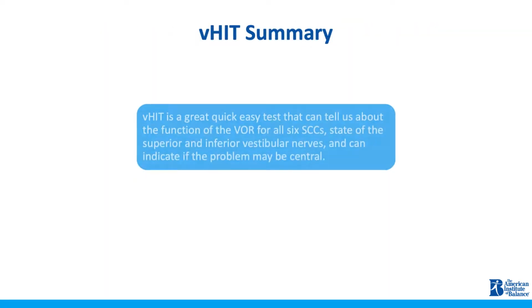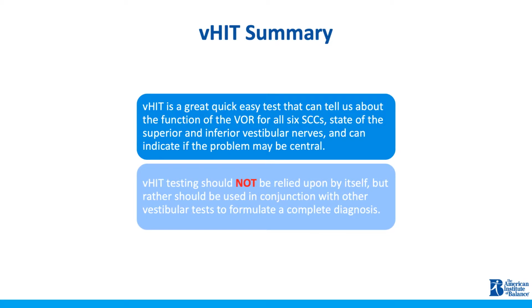What I want you to take out of today's informational video is, if you have a patient that presents with symptoms that lead you to believe that they've had a unilateral vestibulopathy, and they present with the functional complaint of oscillopsia, conducting a vHIT is vital. The combination of patient-reported residual dizziness and reduced gain with corrective saccades present makes you, the clinician, even more confident that this patient would be a great vestibular rehab therapy candidate.